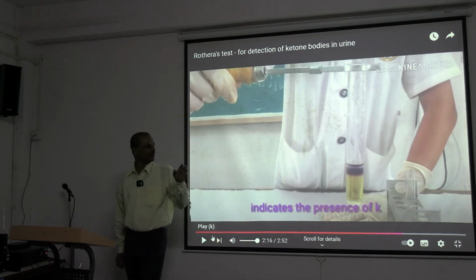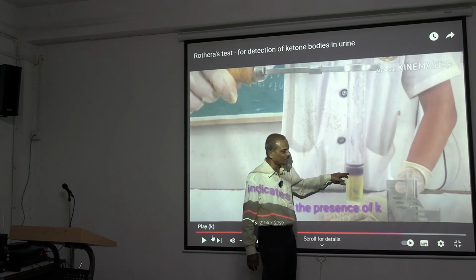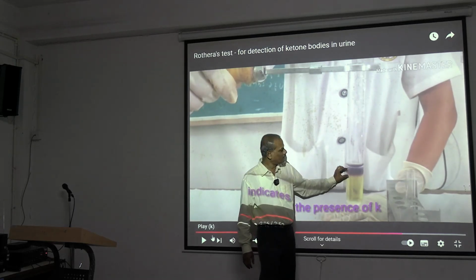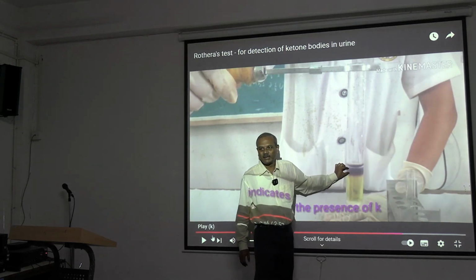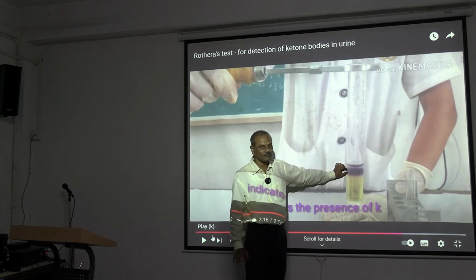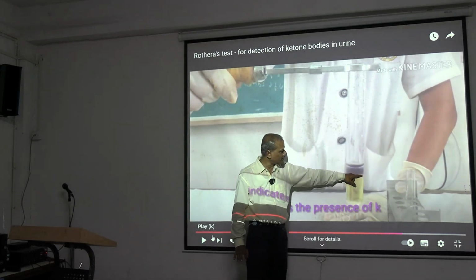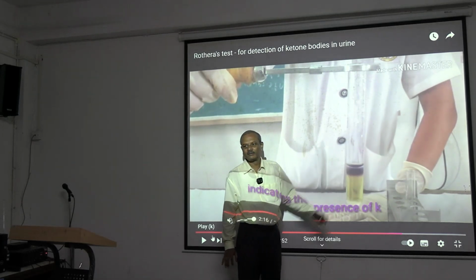So it will not be that thick as well. I am telling you, you will get a very sharp margin. It will not be this much thick. In course of time, it will get thick. It will be widened. The more time you allow, it will get widened. So at the time of formation, it will make a sharp ring just like this one.